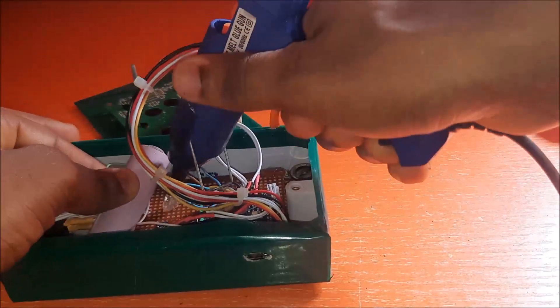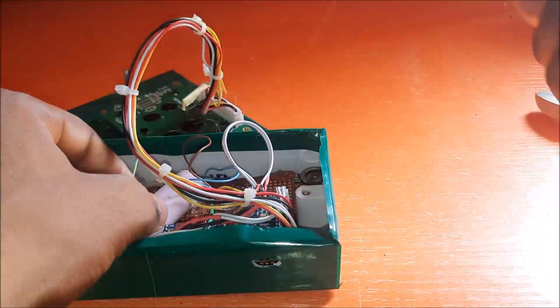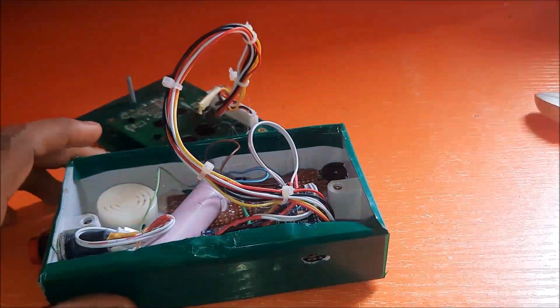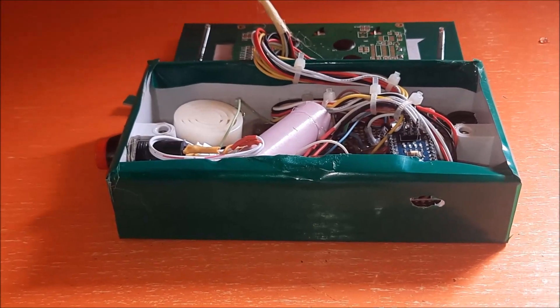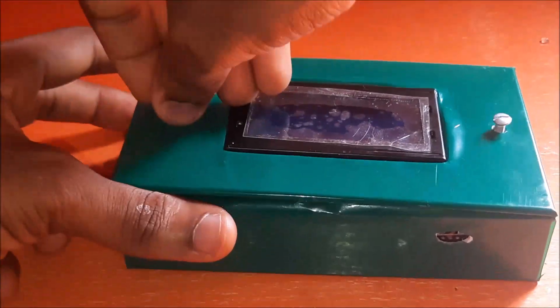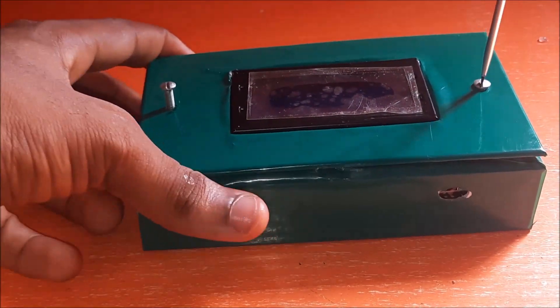The SIM800L GSM module was placed at the side of the casing so that an opening for a SIM slot could be made, making it more convenient to insert the SIM card from the outside. This GSM module is responsible for sending SMS alerts to a professional for medical help during extreme vital readings. It was also used to establish an internet connection to send the readings to the ThingSpeak IoT dashboard.